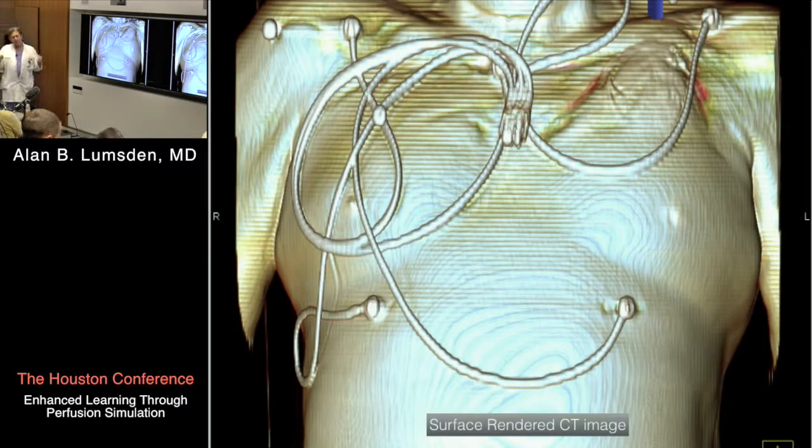If we take an optical scanner, optical scanners are dirt cheap, and we put it on an iPad and we scan you, we can create this picture for almost nothing. Now we can fuse these images together, and we can do it with the patient on the table. And now, once we've got the images fused, we can show you on that table that same kind of viewing system that we were looking at. And so that's how we move. We can't use the $3 million imaging system just to plan a surgical incision.